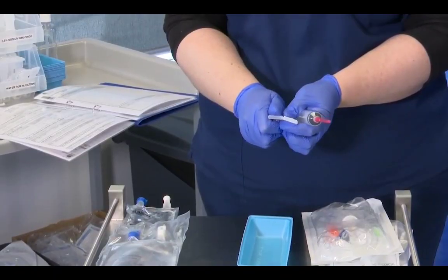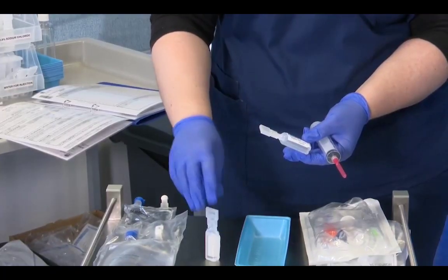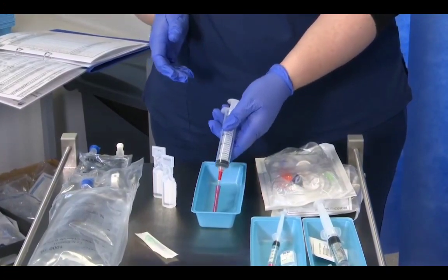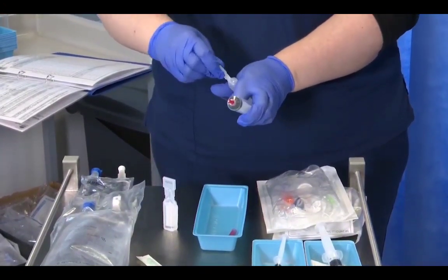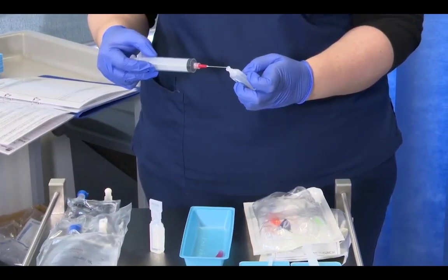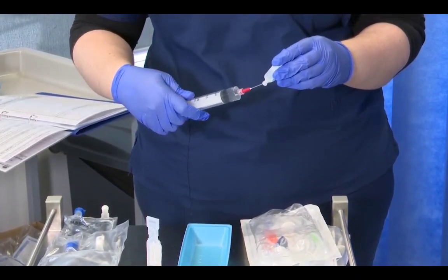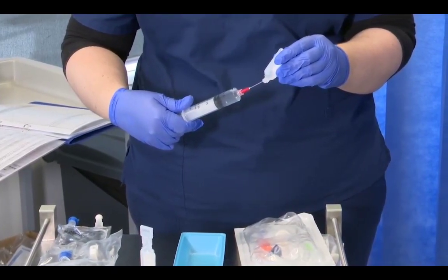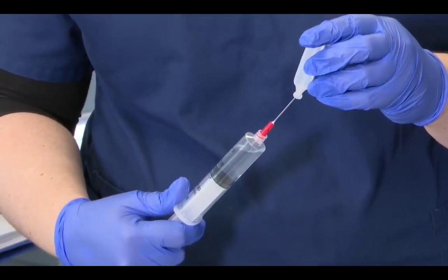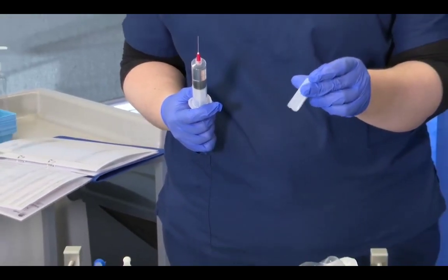I like to separate my two fentanyls, just makes it a little bit easier for me to open them and pull the medication out. So red cap off and into the tray, and the cap comes off. Just exactly the same way as we did with our normal saline, except this time we want to ensure that we get every drop of the medication out of the ampule. Again, we do this by ensuring that at no point does the needle go above the waterline and there is nothing at all left in our ampule once we've drawn that up.